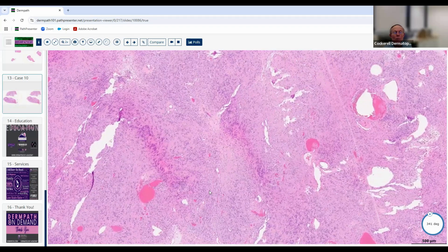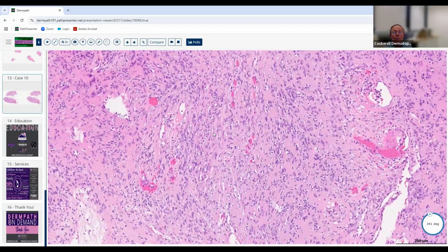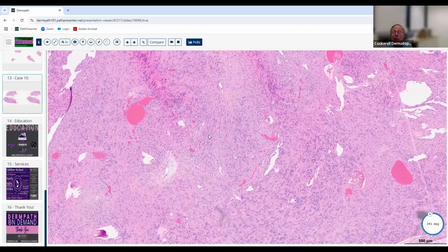And as we do go to higher magnification, we can now see that it's got a spindle cell morphology here. So spindle cell, we think obviously non-epithelial. And the three classic spindle cell types that you need to know for the board examination are fibrohistiocytic, smooth muscle, and neural. That's it. You don't need to know all the other spindle cell things that the soft tissue pathologists talk about for your board examination, which is good news. You just need to know those three. So you need to make sure that you can tell those three apart when you're looking at it.